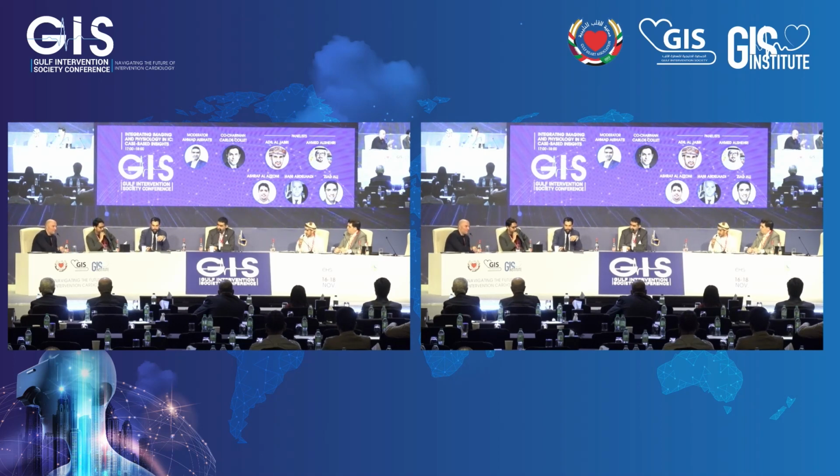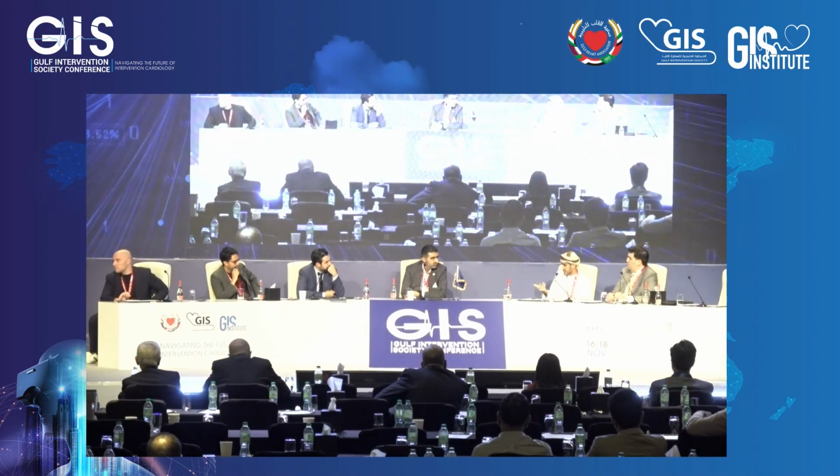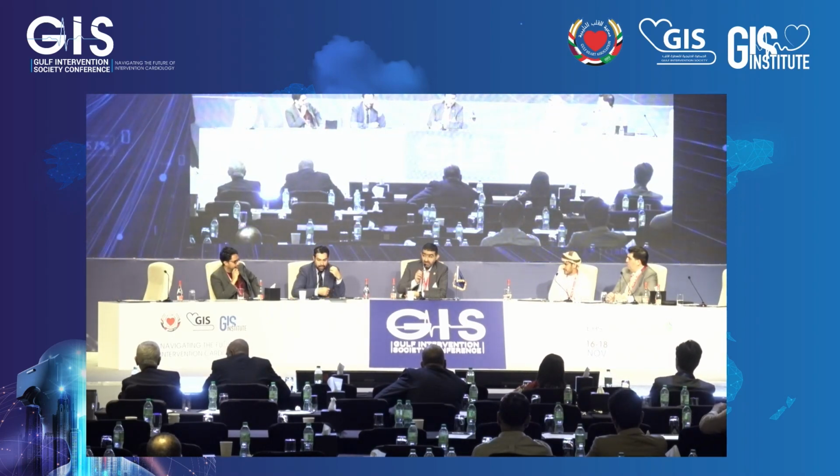If I may jump in, I don't know. In case of diffuse disease, maybe we are not doing a good job in terms of stenting, because maybe we are just stenting whatever we are seeing angiographically, and we are not treating the full diseased segment. Maybe this is why the LIMA long term is better in this case, besides what Dr. Collett was saying about microcirculation. Also, this is maybe something to add.